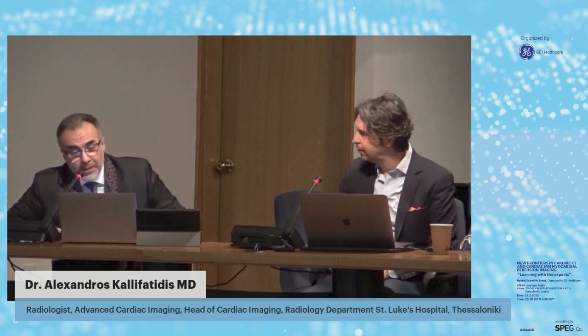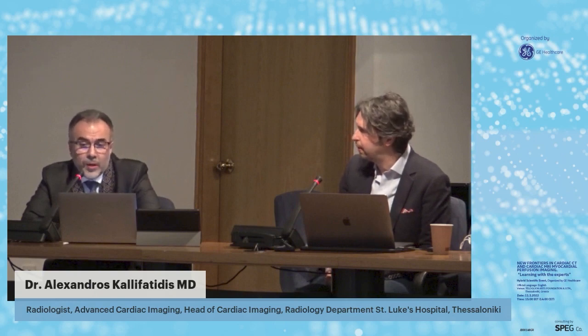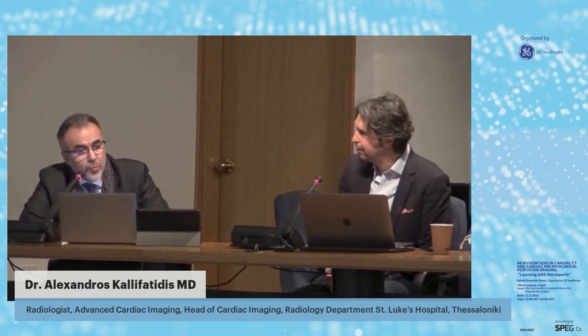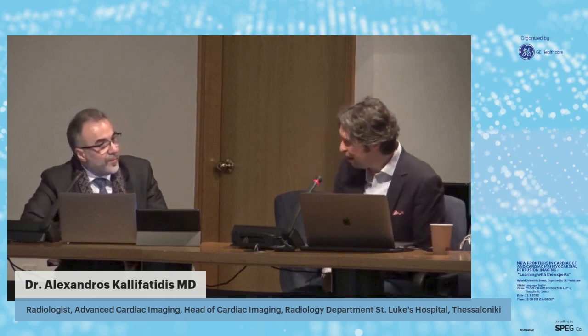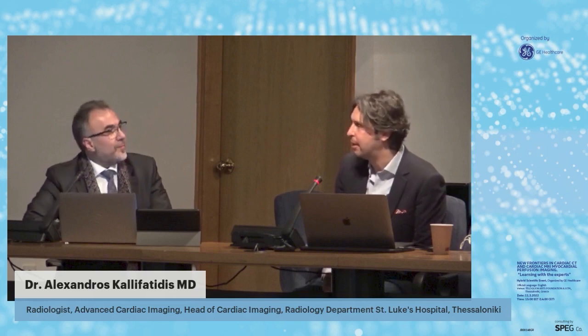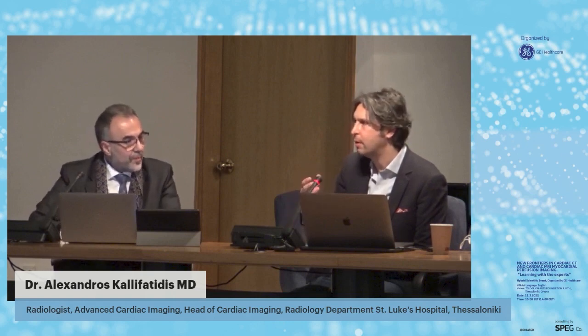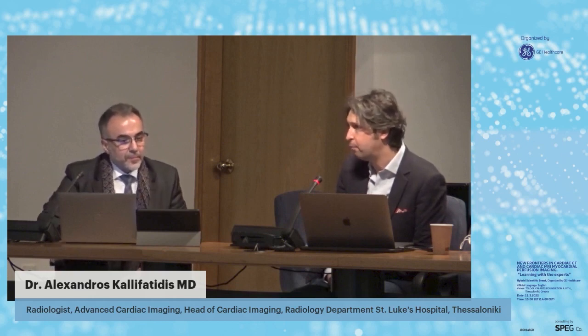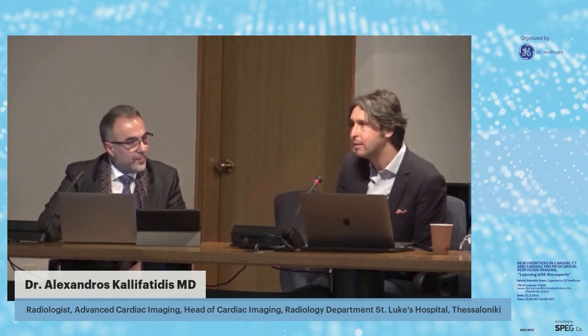Thank you. And one question from my side. According to your experience, which equipment is the best for CMR, the 1.5 Tesla or 3 Tesla? Of course, I think you prefer the 3 Tesla, but what's the preference, and which of these two options is the best? On the contrary, for clinical practice, I prefer 1.5 because it's much more stable. The heart is an organ that is moving, so we have to deal with all this movement and artifacts that we could have from higher magnetic fields like 3 Tesla.